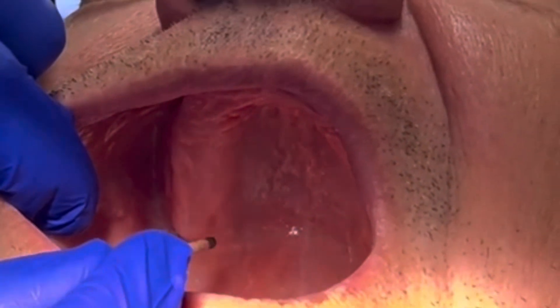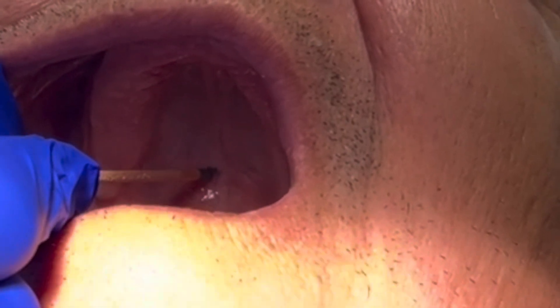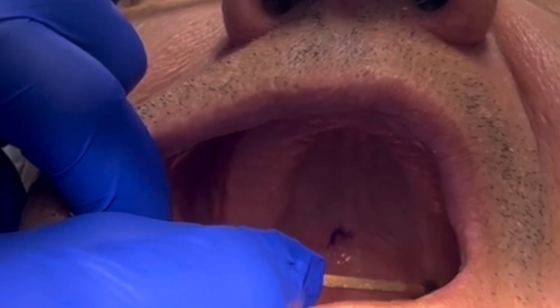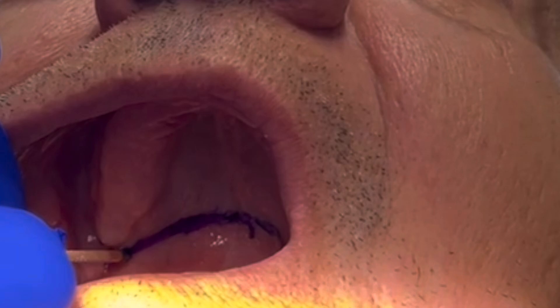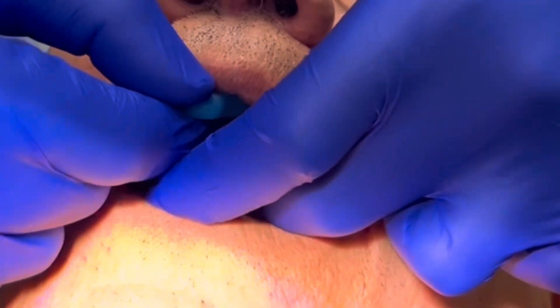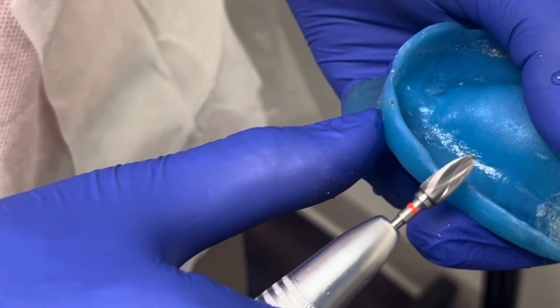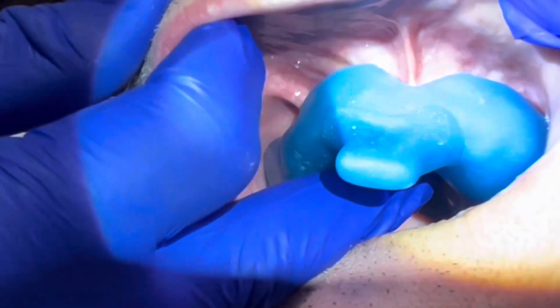Then we'll locate the vibrating line by asking the patient to say 'ah.' We place a dot where we see movement, and then mark both hamular notches, connecting those lines. We then seat the impression tray so that the line marks on the tray, and we can trim the tray to the right extension. Once the custom tray has been adjusted so that it provides two millimeters of clearance between the edge of the tray and the depth of the vestibule, we are ready to border mold.